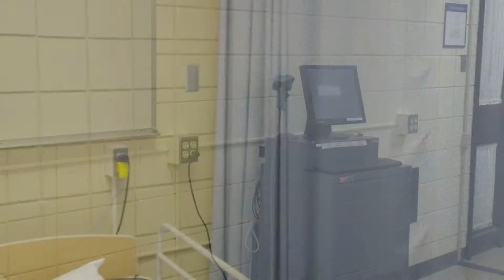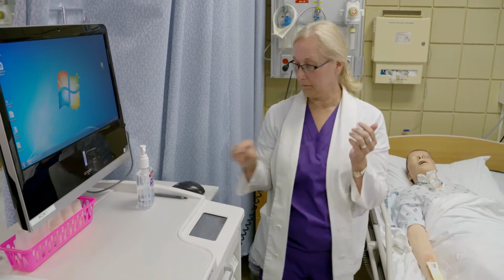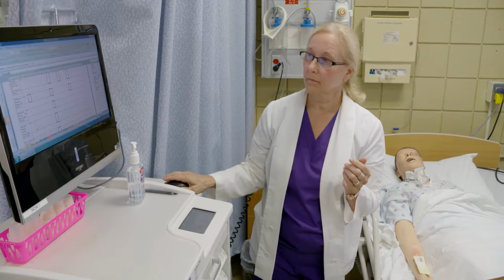The nurse is now in the patient's room. She will perform hand hygiene, open the MAR screen, and identify herself and the patient.